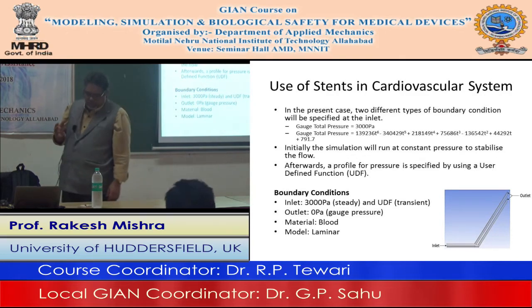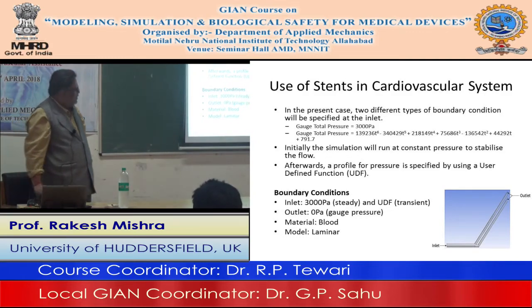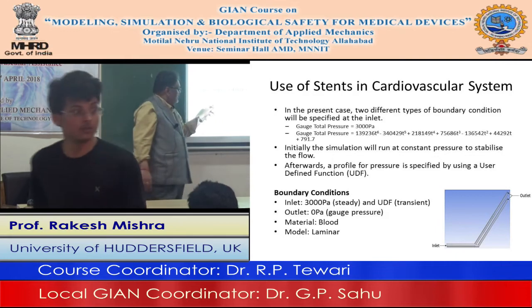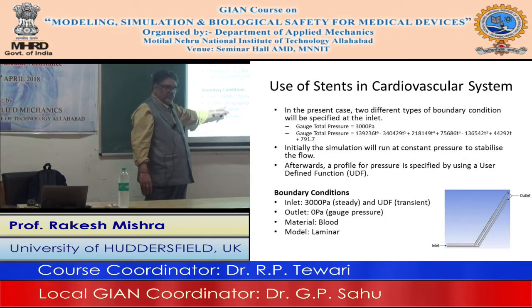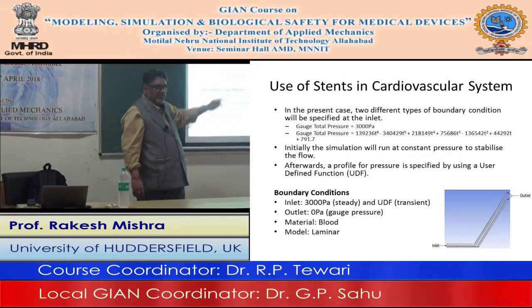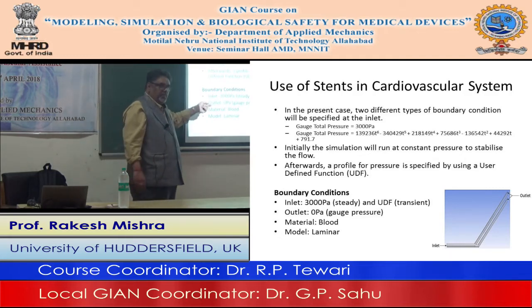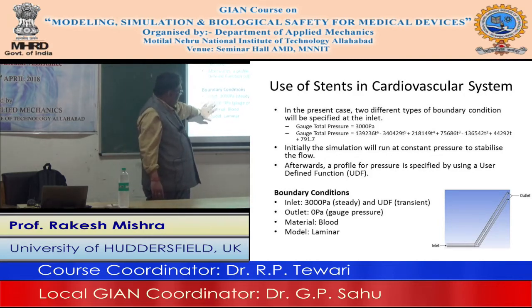Okay, so as you have seen yesterday, the boundary conditions initially are steady flow, 3000 pascal pressure, and then we will have a UDF at the inlet. The outlet, I'm putting it at 0 pascal. As I mentioned to you, you can put any value here. You then have to increase the inlet value to compensate, because pressure is 0 gauge, which means 1 atmosphere. But in fluids, especially incompressible fluids, it is the difference of pressure that matters and not the actual pressure values, because it is incompressible and the pressure-density coupling is not there. The material is blood, so we will put blood's viscosity and density, and then we will run laminar flow through this, because that is what we mostly observe. So we will have laminar flow, steady and transient motion, outlet and blood.